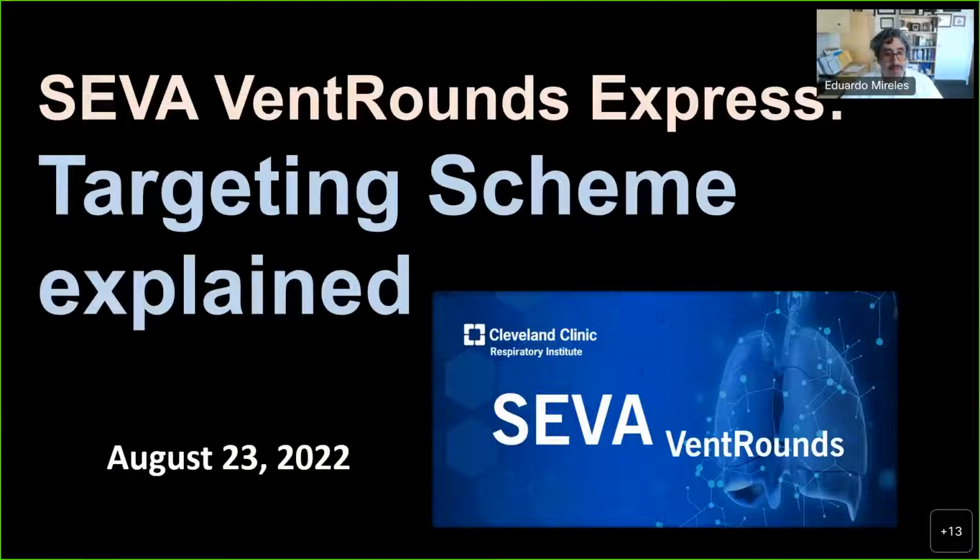Okay, so let's just review what we have discussed so far. We talked about what is a mode of mechanical ventilation, and essentially it's a predetermined pattern of interaction between a patient and a ventilator, and it's a combination of three things: the control variable, the breath sequence, and the targeting scheme, and these three together create a mode.